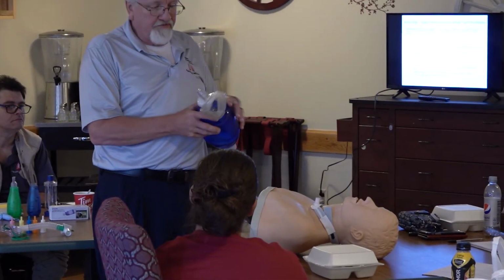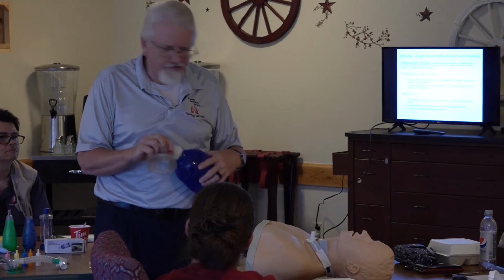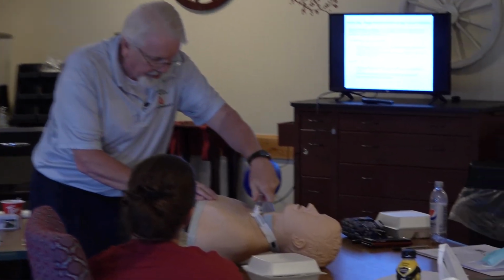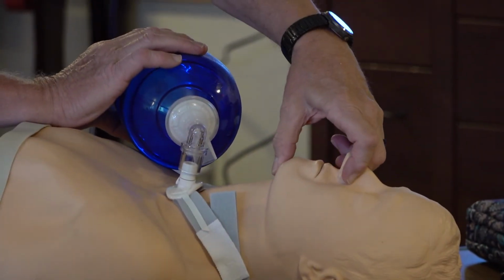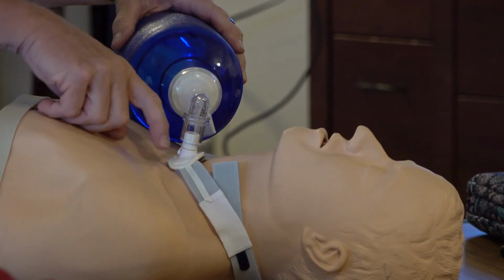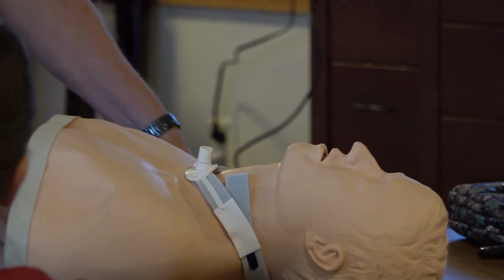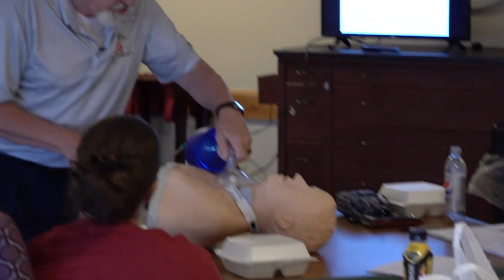And I'm going to go ahead real fast, like I remove the gauze, and I can do one of 2 things. I can either use the mask, which is probably preferred in his case. Why? Because if I hook directly to here, I close the nose and close his jaw, and I give him a breath, I still have area around that trach and stoma, so he's not getting all of it.